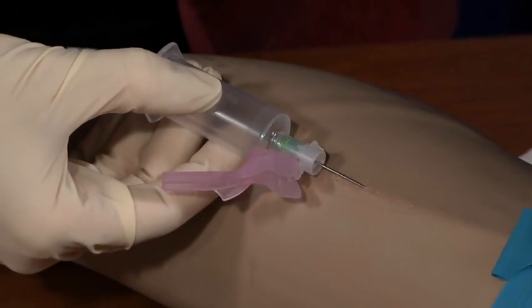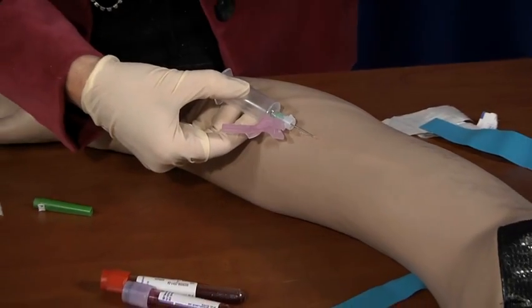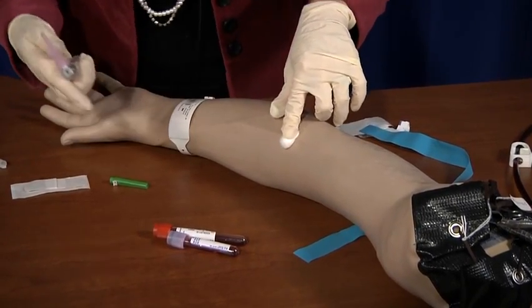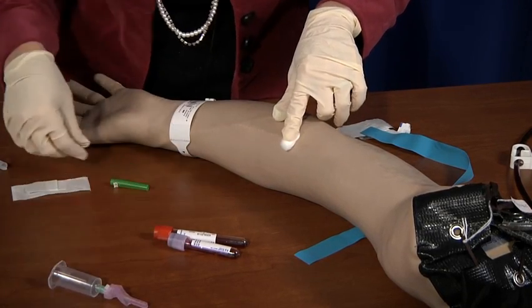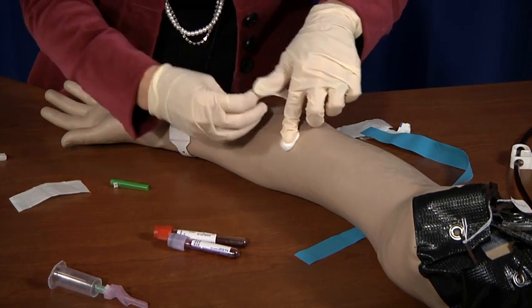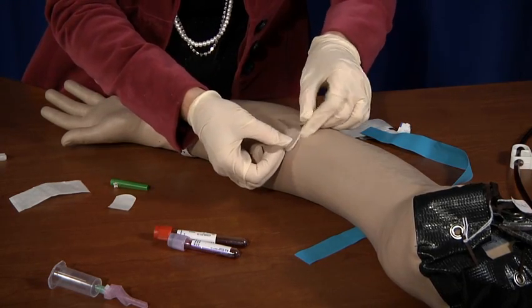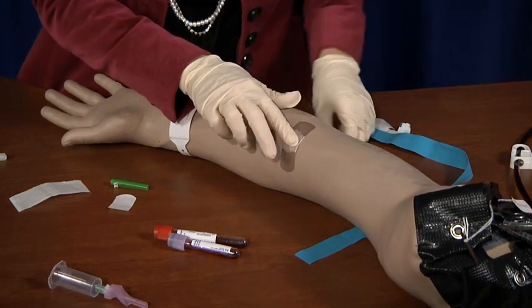Release your tourniquet. Get your cotton ball and take your needle out. Safety first. Cover your needle, put it to the side. Hold pressure, and if there are any kind of blood thinner, you may have to hold it for a little bit longer. And then apply your Band-Aid. And you can put that over the cotton ball if you need to. And that's it.